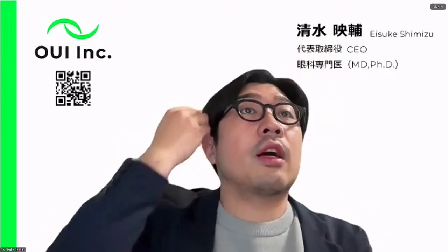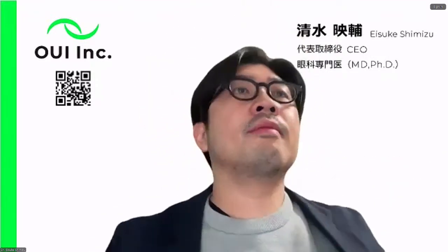Actually, this device is unique to my team because we developed the device ourselves. However, there are a tremendous number of smartphone technologies for the anterior segment, but interestingly, no one is using video. I think the reason is that they don't have the idea to build two stages of AI. One is extracting the diagnosable frame, and the second is detecting cataract or whatever you want to see. This combination is a pretty interesting point in what we built.